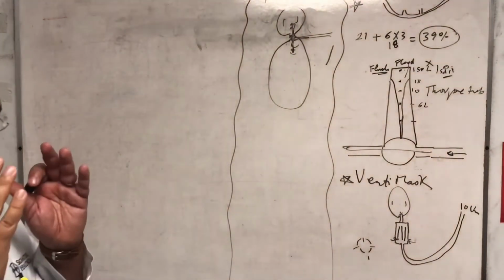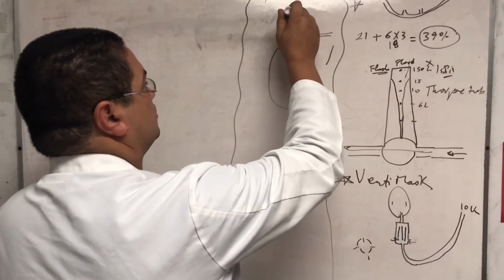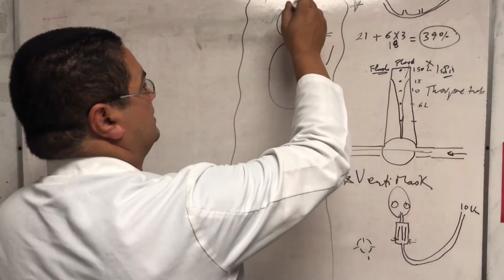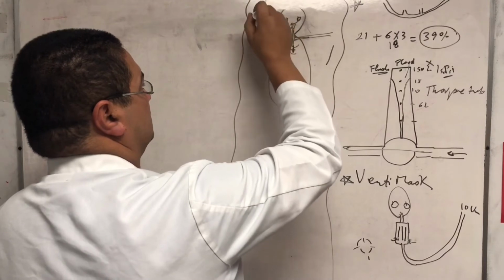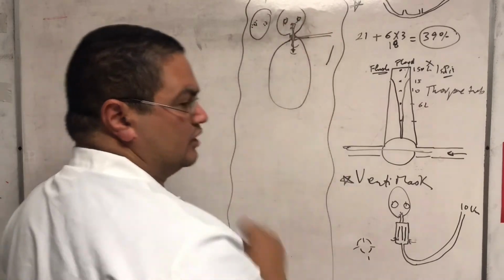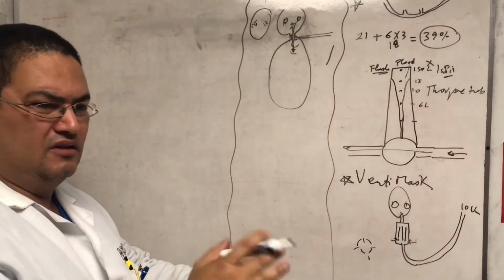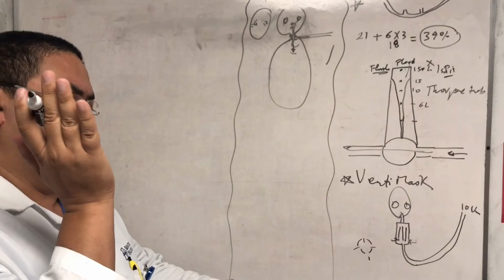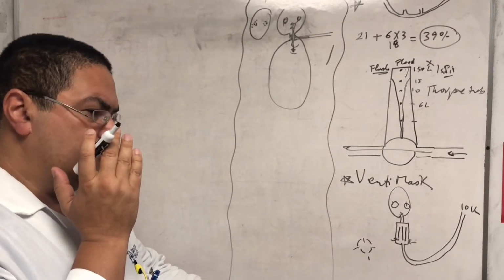The mask is a little bit more fit, a little bit more tight to the face, and also instead of the holes that this mask have, it has like a collection of holes, so like this. So the mask looks like this. Like openings, small openings like this, and small openings like this here, instead of the one big hole. And one of them at least has a one-way valve on it. Like a little diaphragm, a little disc that will open up as the patient is exhaling, and then as the patient is sucking in, it will close. So most of the air will come from here.